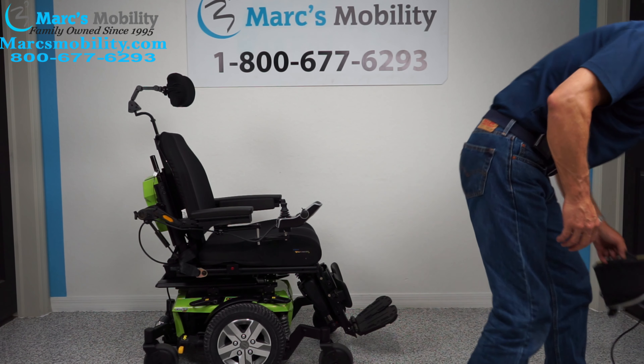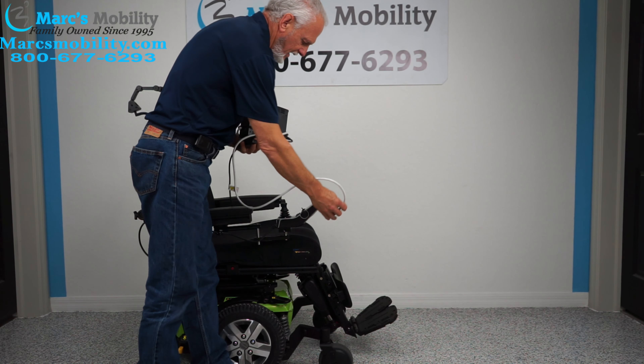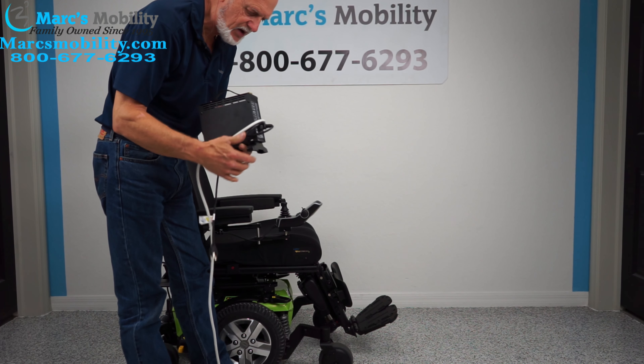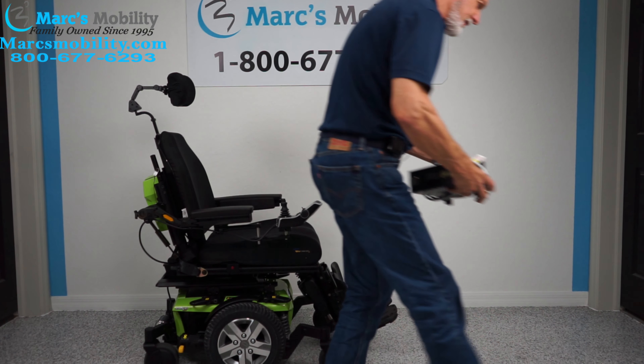When you charge this chair, you take your charger and plug it right below your joystick. As soon as the light goes from orange to green, you're fully charged. The charger knows when the batteries are full and it'll stop charging automatically.